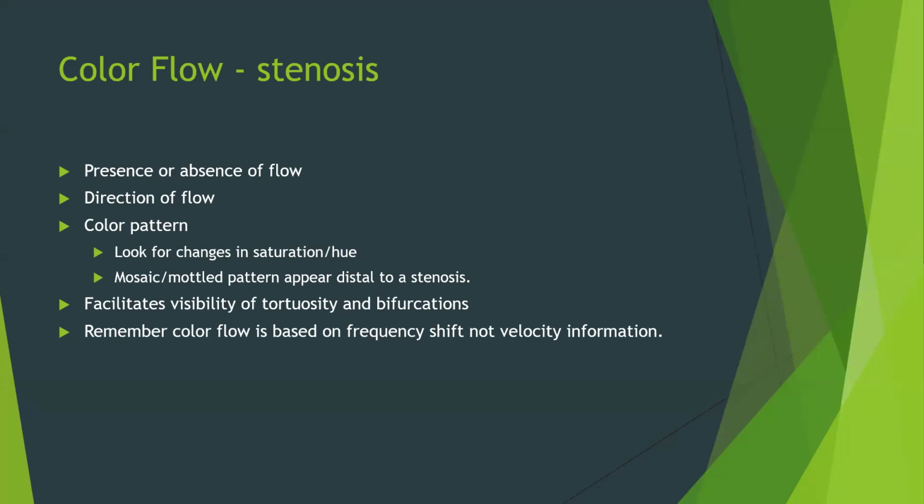And remember that our color flow is based on frequency shift, not velocity information. So it's that shift from one area to the next and not necessarily based off of the velocity.